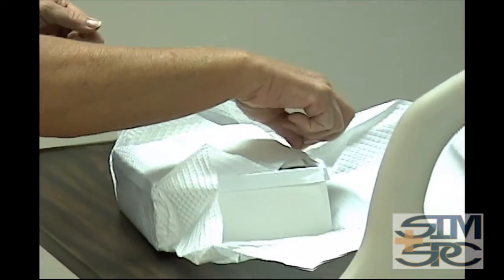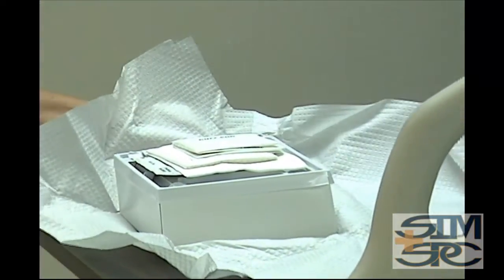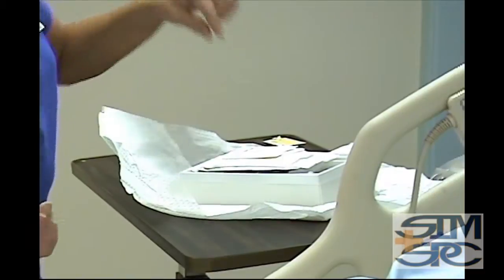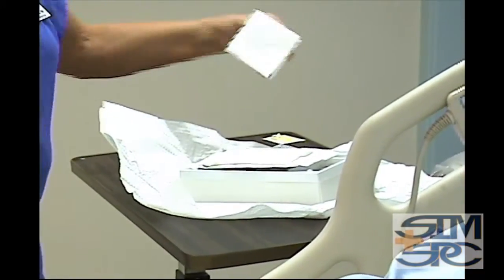What I'm going to do is square it off just a little so that I have a place where I can put my gloves on. And here's the cut glove, and every kit's placed a little different.